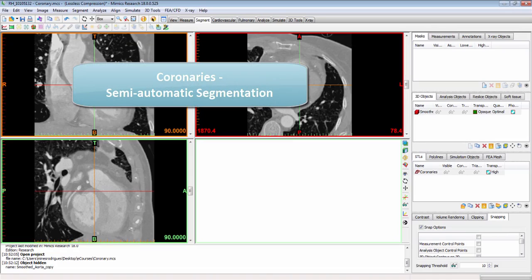Coronary artery disease is one of the leading causes of death in recent times. For regulatory approval and clinical success, the mechanical properties and the biocompatibility of the stents play a crucial role. In medical device companies, the R&D department needs anatomically relevant data either to improve existing products or to initiate development of new products. On the other hand, clinical research departments can benefit from advanced analysis of patients for clinical trials.